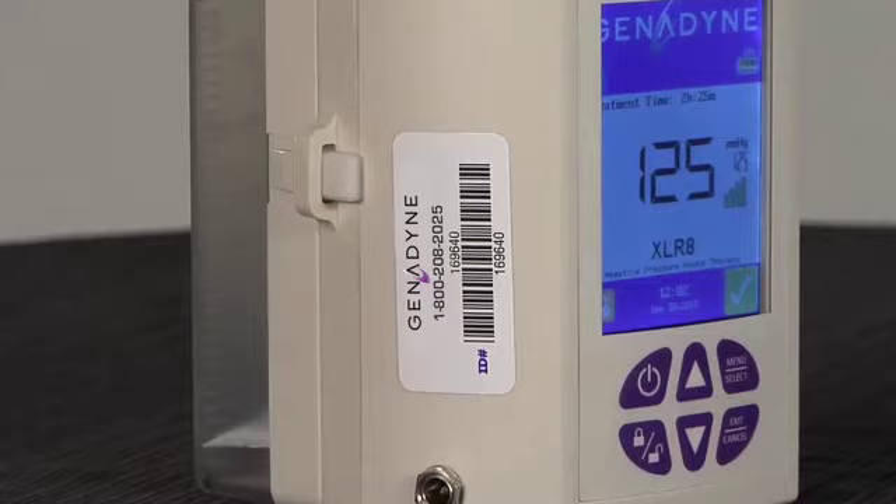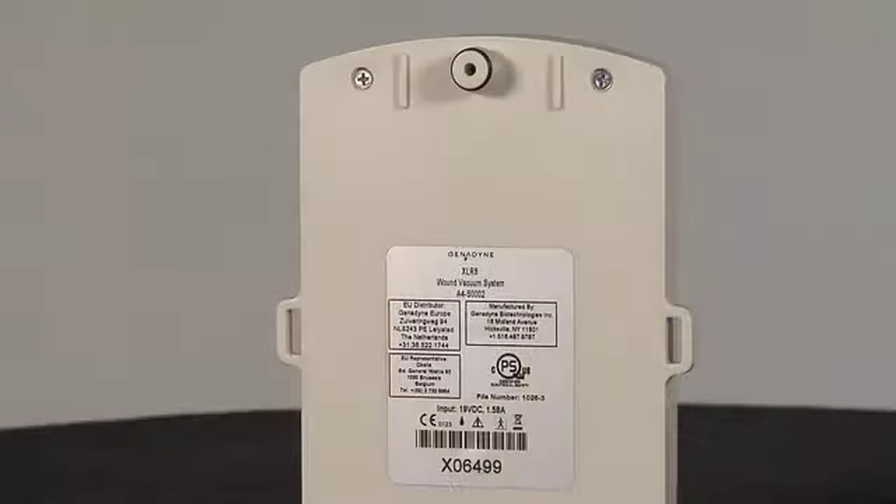The Genodyne asset tag is important and must remain on the unit in order to track the device as part of the compliance process. In addition, the Genodyne 800 number is clearly visible on the asset tag should it be necessary to call for an in-service or support. Eyelets are located on both sides of the pump and are used to connect the collection canister to the back of the pump. On the back of the pump is the vacuum connection port, which is connected to the collection canister.